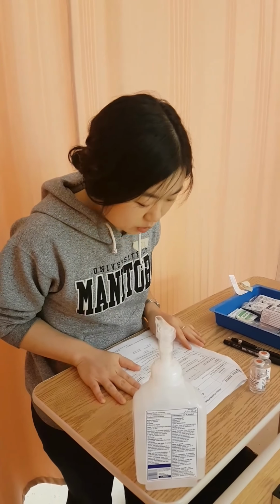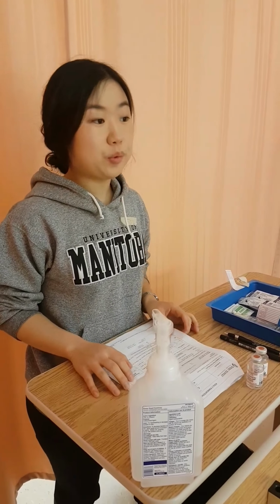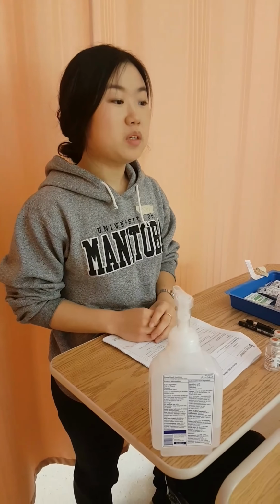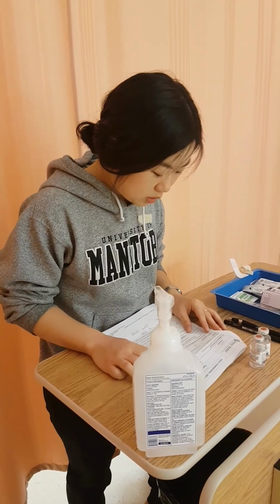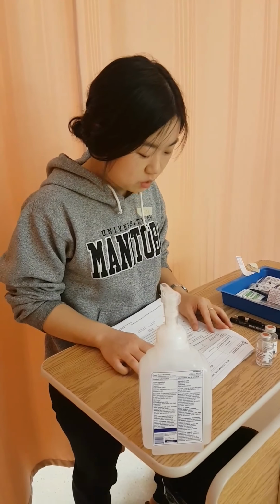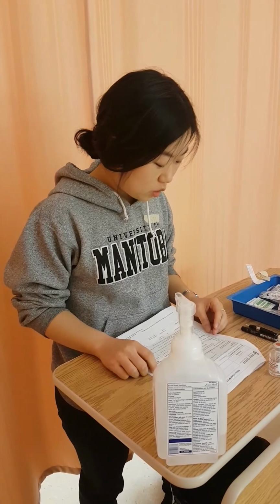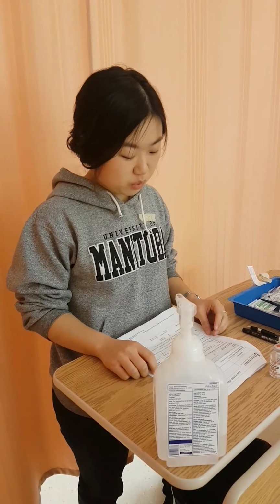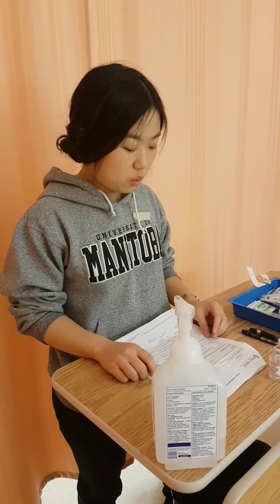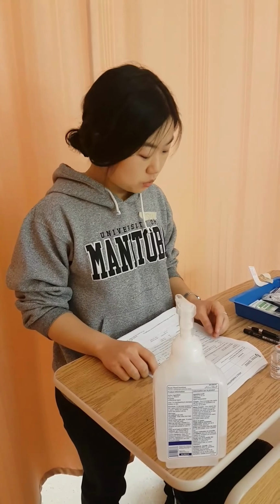According to the parenteral drug monograph, Ceftriaxone is an antibiotic, and this is appropriate because this patient was admitted with a respiratory tract infection. And according to the policy, this can be administered by a student nurse, which is applicable to me because I'm a student nurse. The usual dosage goes from 1 to 2 grams IV every 24 hours, and the ordered dose is 1.5 grams every 24 hours, so it's within safe range.